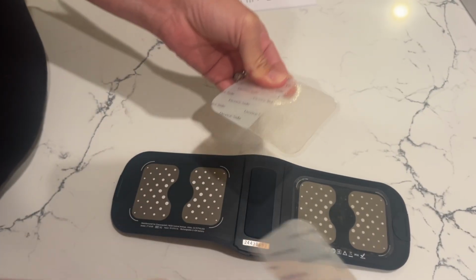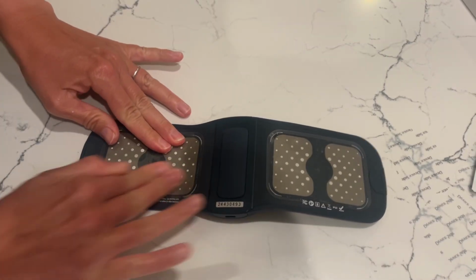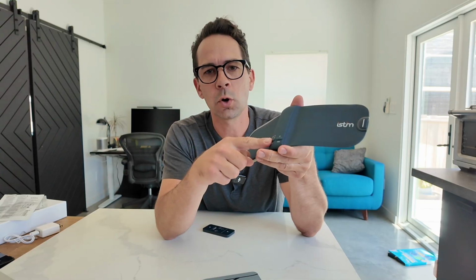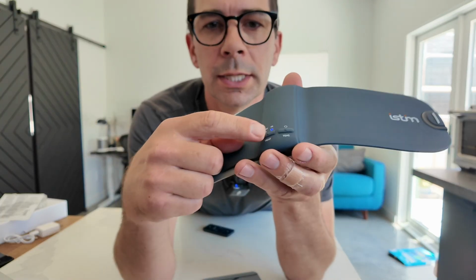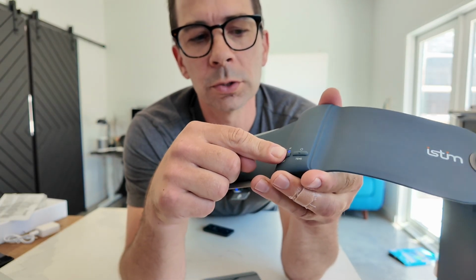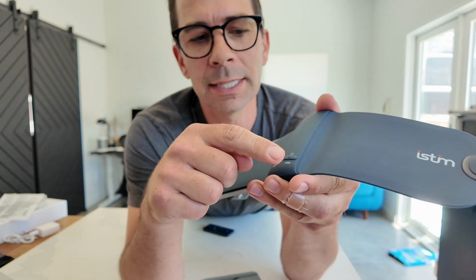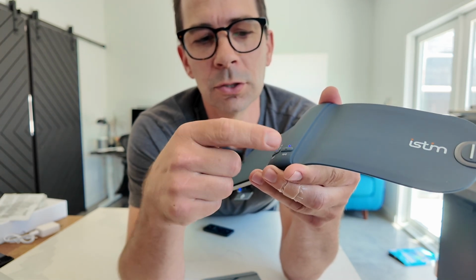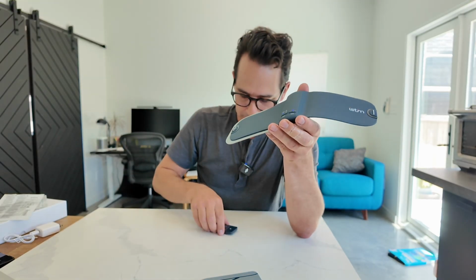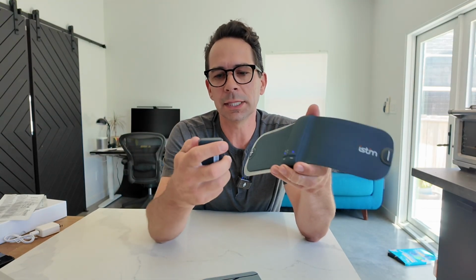To operate the device, you're gonna wanna put these adhesive pads on there first. And to turn it on, you can hold down either of the buttons for 3 seconds and you'll hear a beep and see an indicator light. And then you are able to either turn the heat to high or to low, and then you can activate the TENS by holding that down for 3 seconds as well. And then you can go through the 15 different modes or 15 different intensities of TENS stimulation.